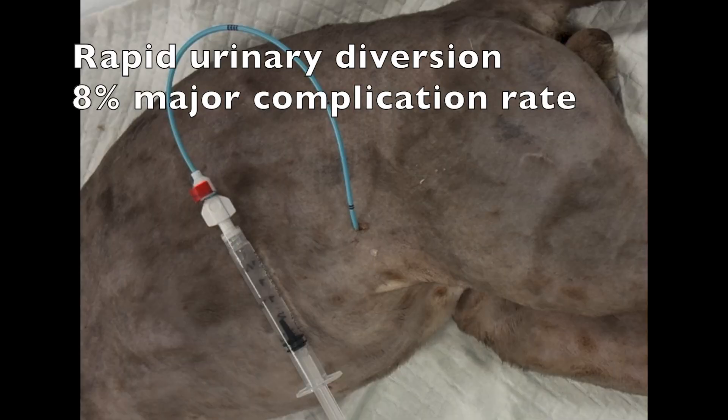This is a demonstration of percutaneous pigtail cystostomy catheter placement in a cat. It's a rapid, minimally invasive method for urinary diversion in patients where retrograde urethral catheterization is not possible and those that are poor candidates for prolonged anesthesia.